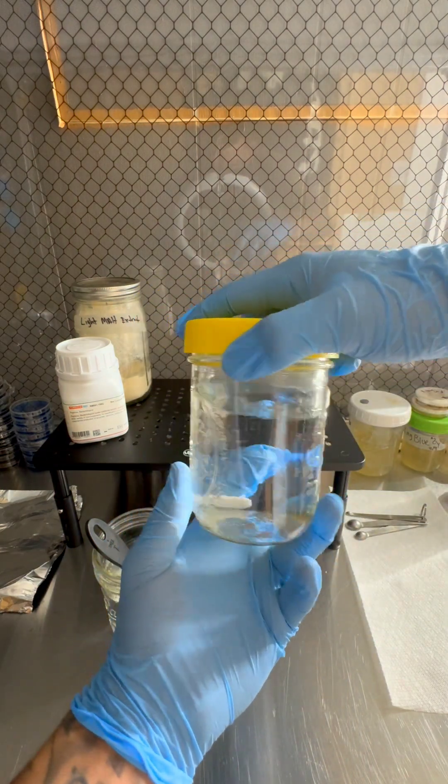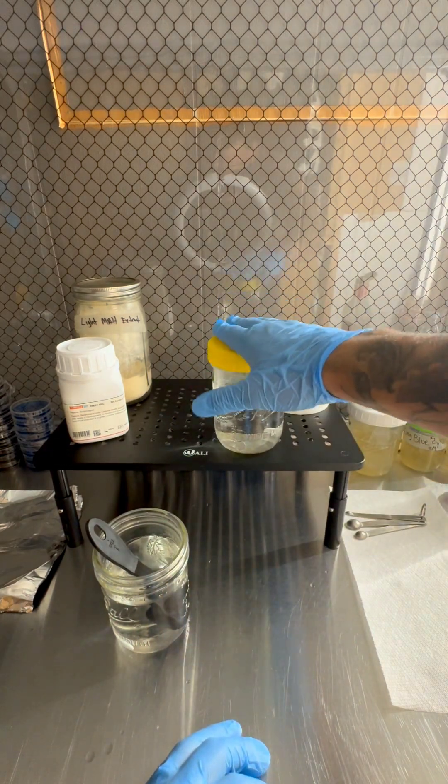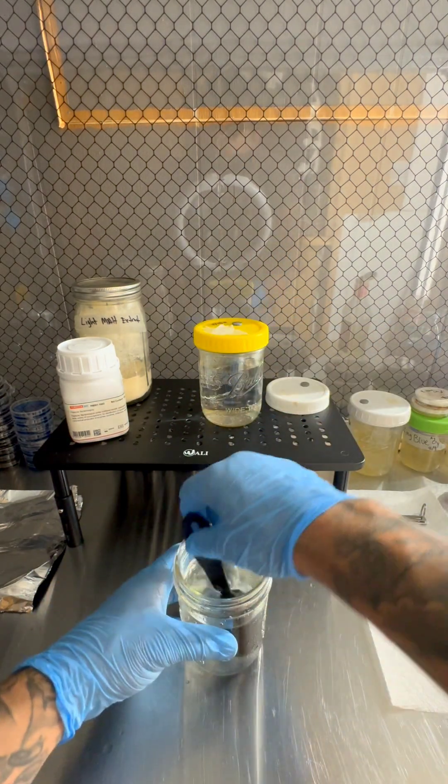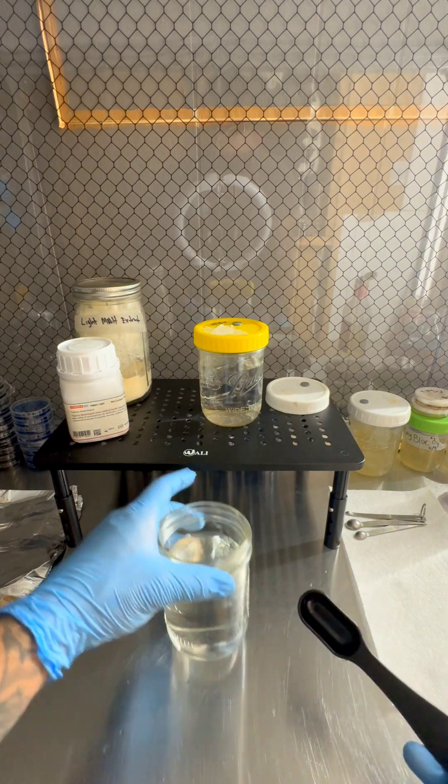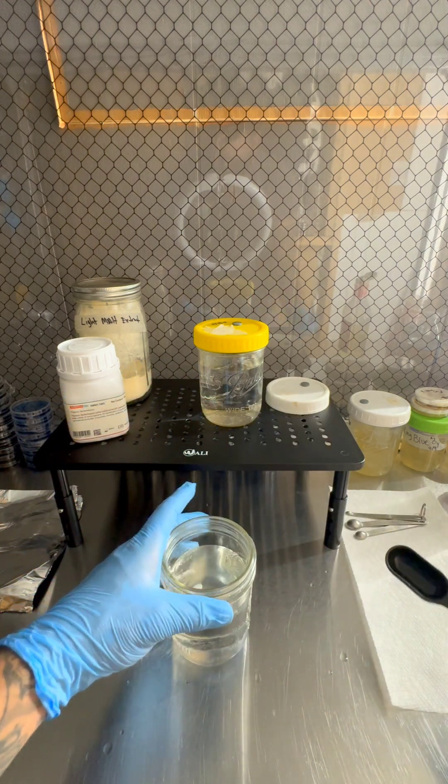300 milliliters of water, one tablespoon of Karo's corn syrup. So that's going to be your basic liquid culture. And then I'm going to show you my recipe. So this is also 300 milliliters of water with one tablespoon of Karo's already in there.